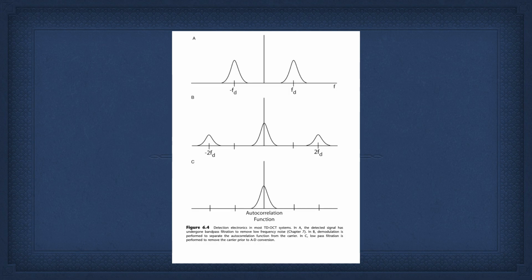So this shows, or hopefully it shows, that the initial signal coming in is Doppler shifted. If we think the signal we want is in the middle, and we're at the top, A, we don't yet have our autocorrelation function, what we want to use to represent and put in our pixel. It's Doppler shifted.